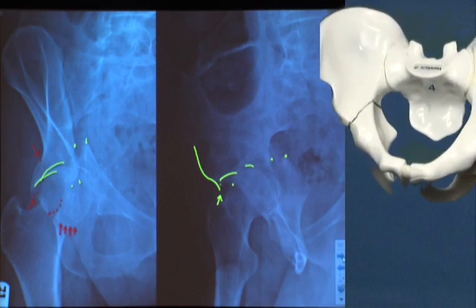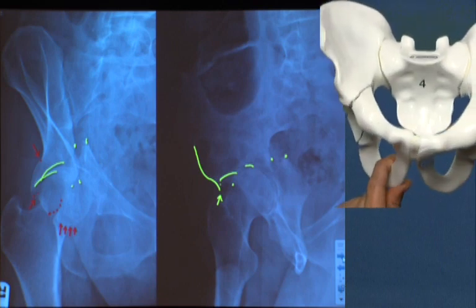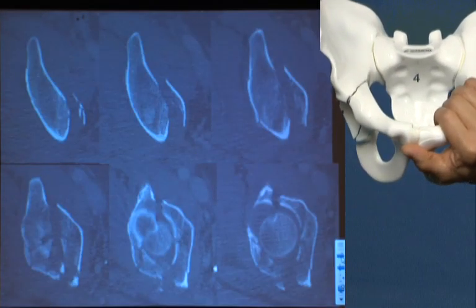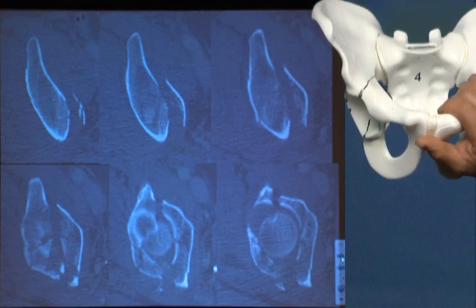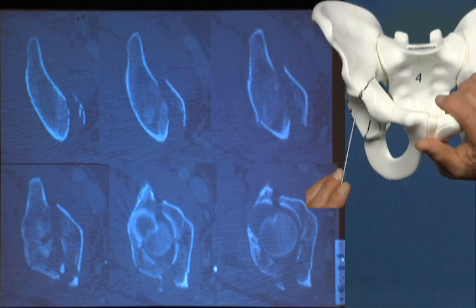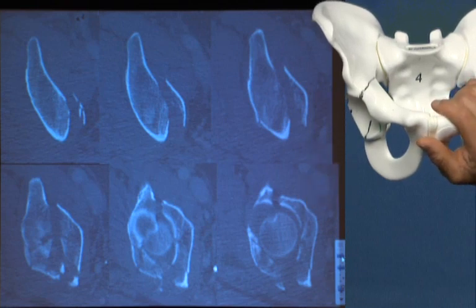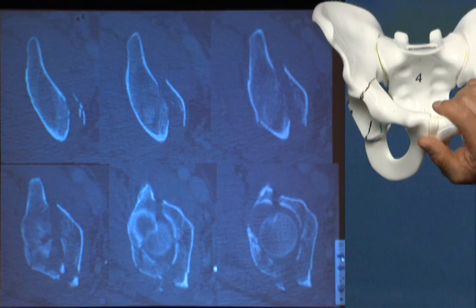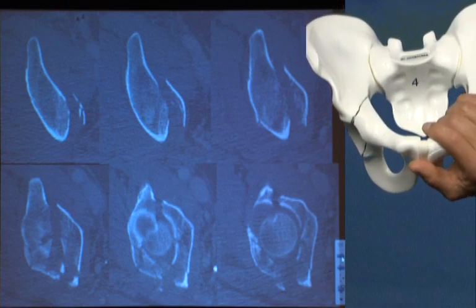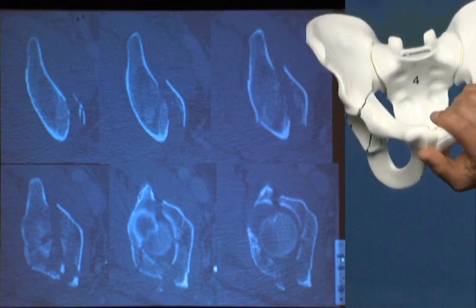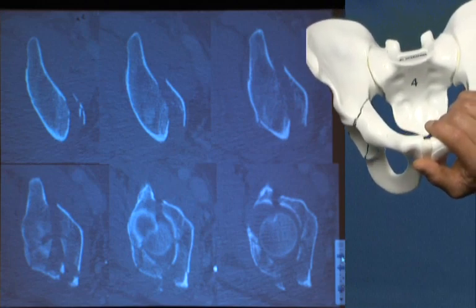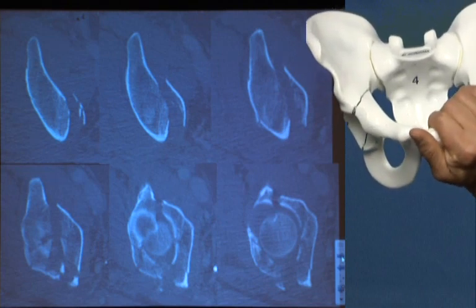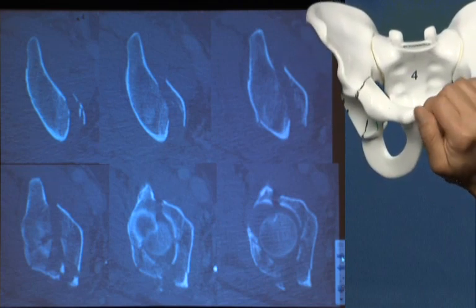At this point we're going to go to the CT scan and use that anatomy to help confirm our drawings and finish those radiographic features we haven't been able to fully understand — such as the articular impaction and the multifragmentary nature of the posterior wall or posterior rim. It's very typical that you can get a lot of information about the main fracture lines and where they cross the radiographic landmarks from the plain films, but we still get additional data from the 2D CT scan regarding these other difficult areas to visualize.